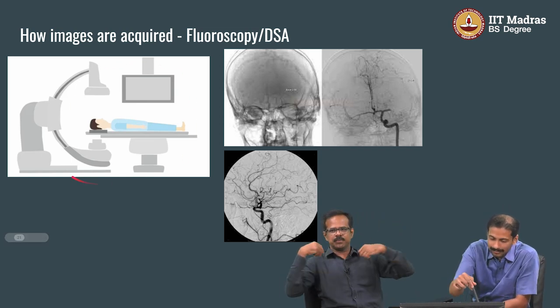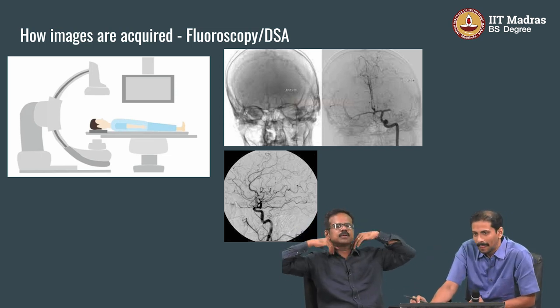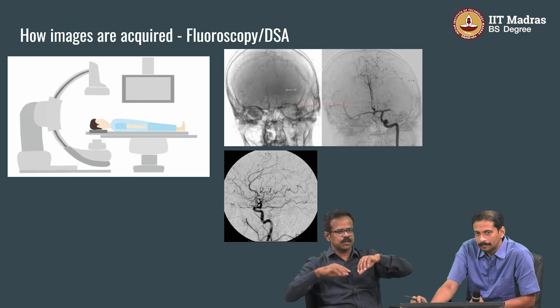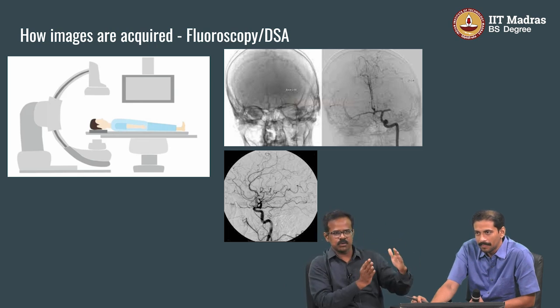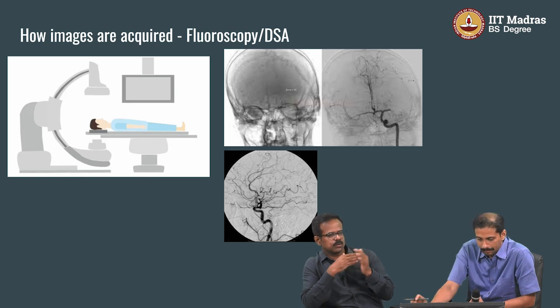We put on lead aprons, we cover our head, we put on a neck collar, and after that there will be lead barriers to block the X-rays, and lead glasses. We can see through them, and they will block the radiation also. And we will have dosimeters tagged here, and we have live dosimeters also, showing how much X-ray radiation is going on, and the cumulative dose also.